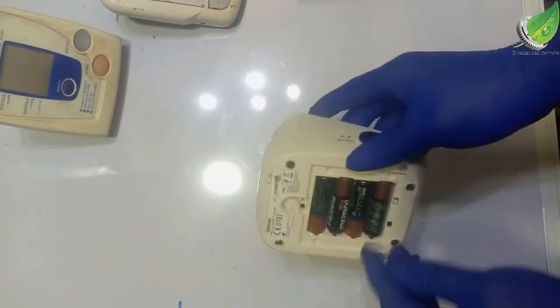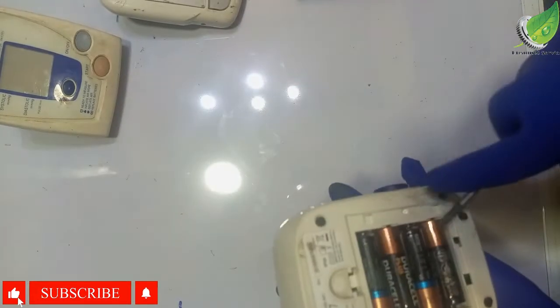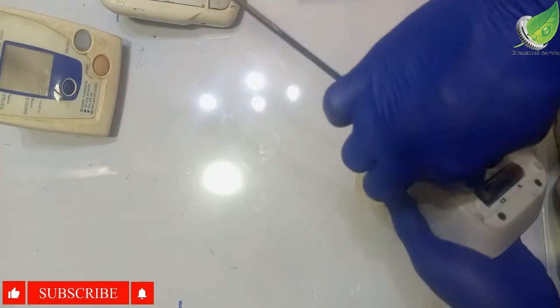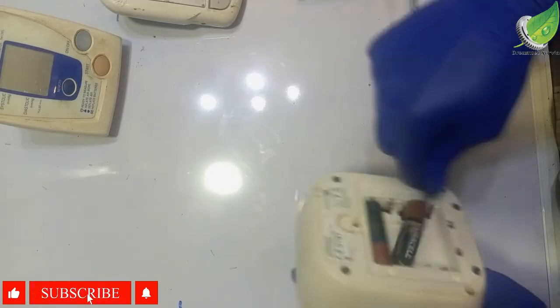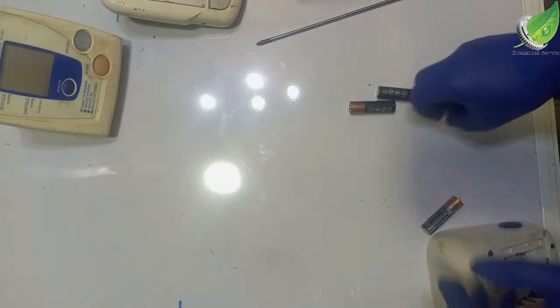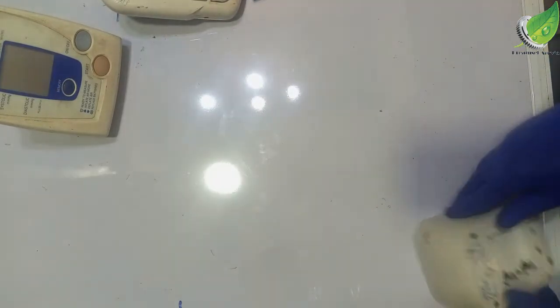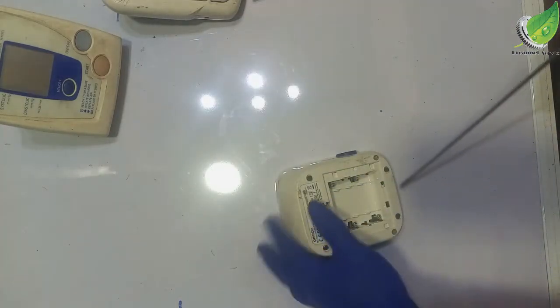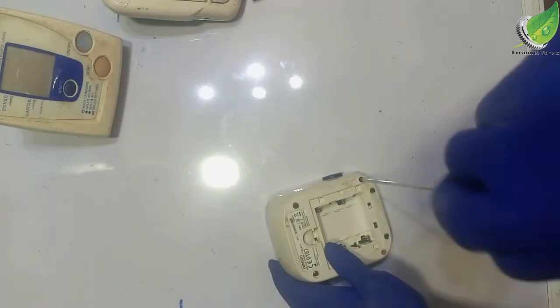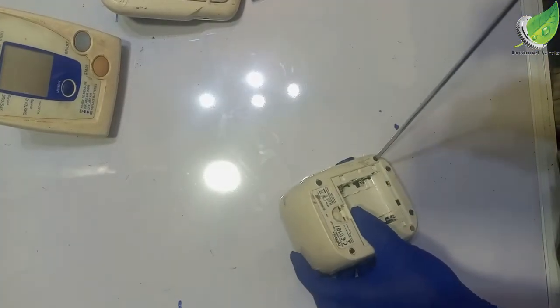So the first thing we want to do is to take out the batteries. So I have my 4 batteries here. I'm going to set them aside and then we are going to fix this. So we have some screws here, 4 screws at the back that we need to remove. So get your screwdriver inside that area and gently remove the screws.